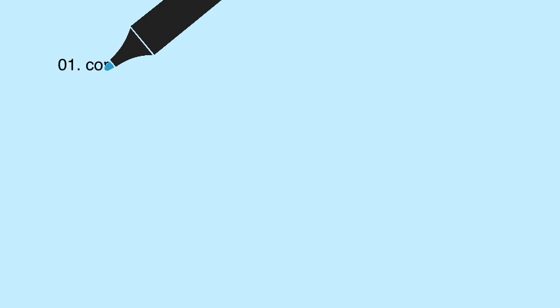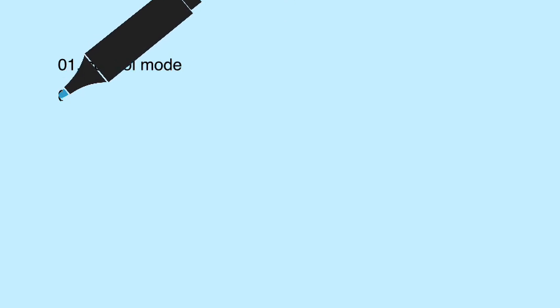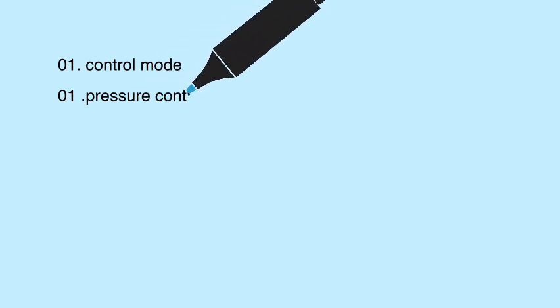As I mentioned, in the control mode there are two main categories, pressure control and volume control. In pressure control mode, usually the pressure is fixed. So usually airway pressure will be around 15 to 20, or 25 will also be acceptable. When we give the pressure from the ventilator, when they are ventilating the lung, they are not going to exceed that pressure.